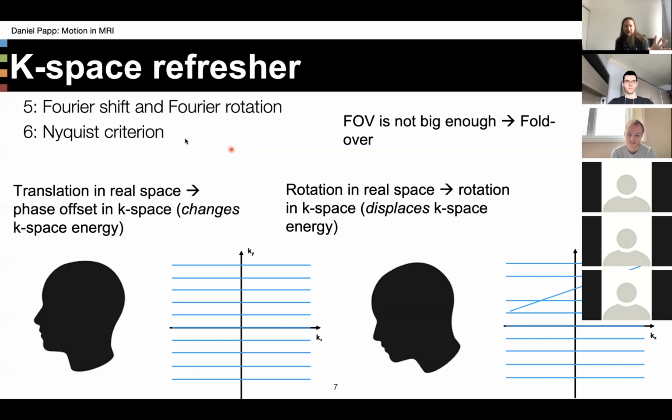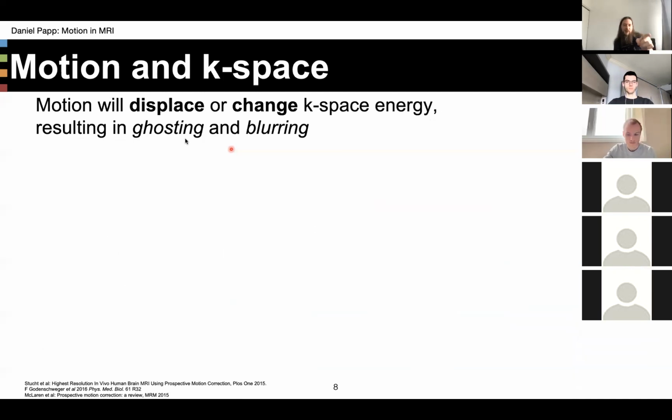It just makes sense to me in the way I interpret k-space, but this is not an image reconstruction lecture, so I'm not going to go too much in depth. But I think the main takeaway is that motion basically puts k-space energy into places where it shouldn't be. And that's where all of these issues come from. That's why you get these wave patterns, distortions, etc.